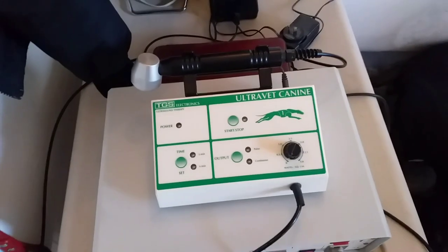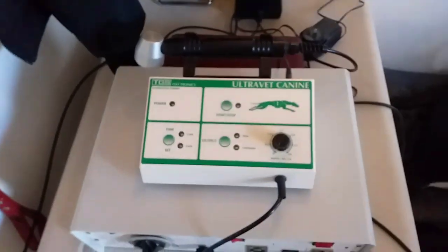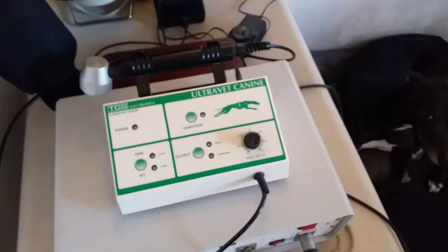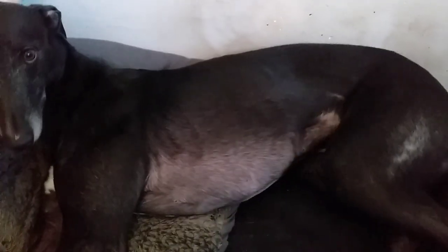With this machine you can basically treat injuries that are in deep muscle — anything that isn't bone. So we are talking about these muscles: hind quarter, here the shoulder, some parts of the neck, the lower parts, and the insides of the legs of course. It always depends on the wattage per square centimeter you use. But it can also destroy a lot in your dog, and I'll tell a little bit about that more later.